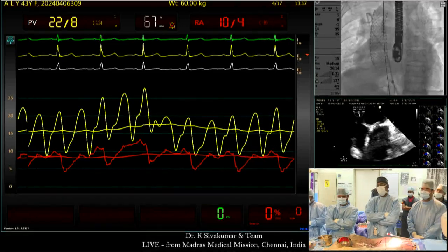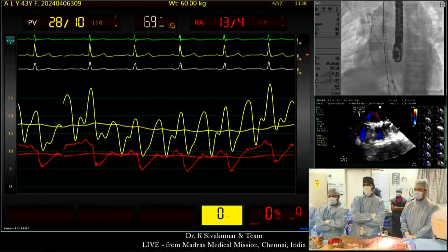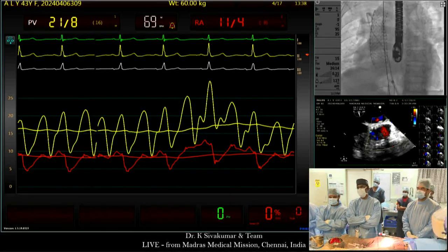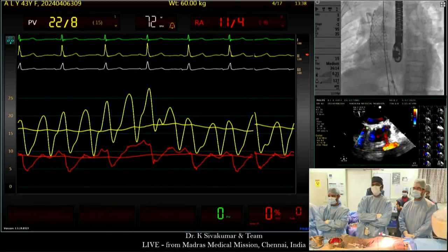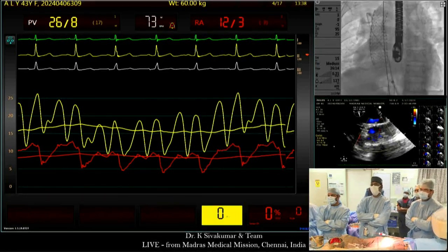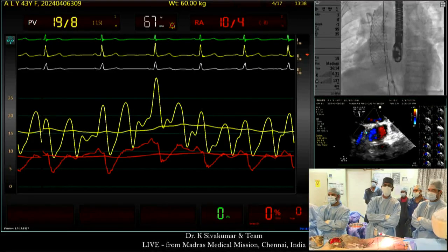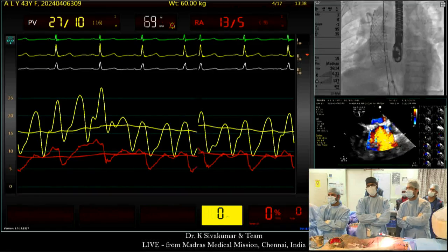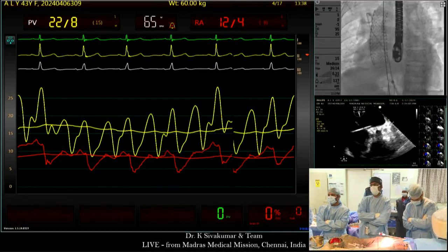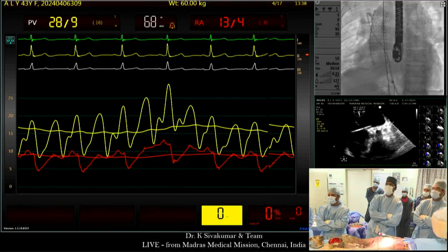Having said that, the course of the sinus nodal artery in the superior cavo-atrial junction is epicardial. So by giving a pressure from inside, an epicardial artery will not be injured a lot. On the contrary, when the surgeons do the dissections, the epicardial artery is more likely to be traumatized, not necessarily directly, but even by the incisions in and around it, which will produce fibrosis and will lead to sinus nodal arterial strictures over a period of time. So the chances of sinus nodal injury, I think with either a balloon expandable or a covered stent, are by and large very uncommon. The reason being the artery is epicardial.